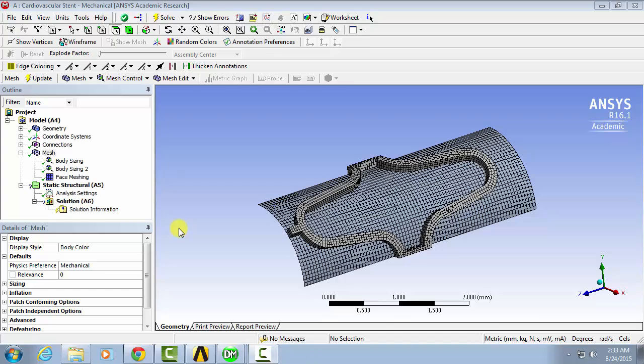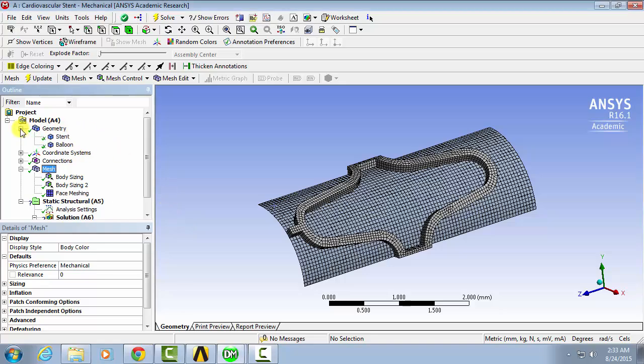Now that we've defined the mesh, we'll start setting up the physical problem. We'll start by selecting the material properties for the stent and the balloon.